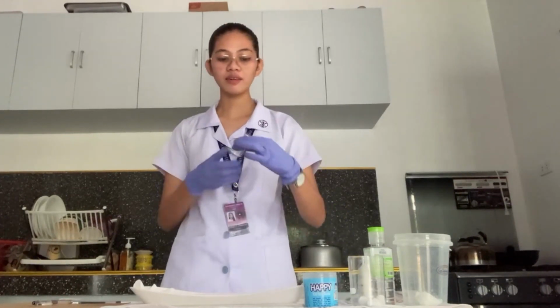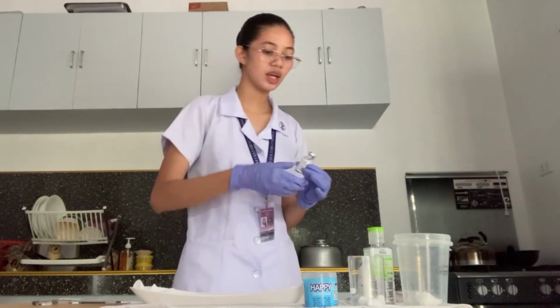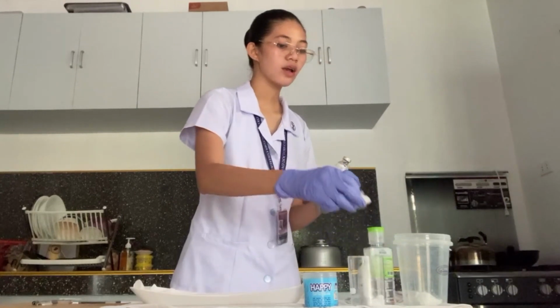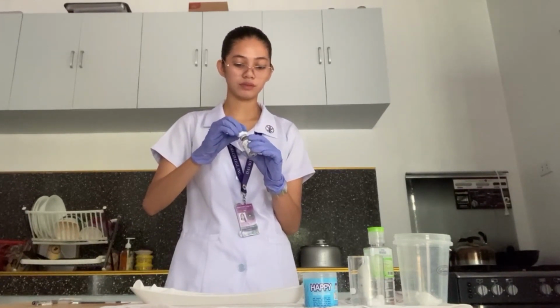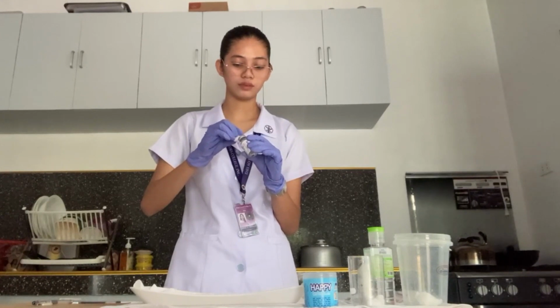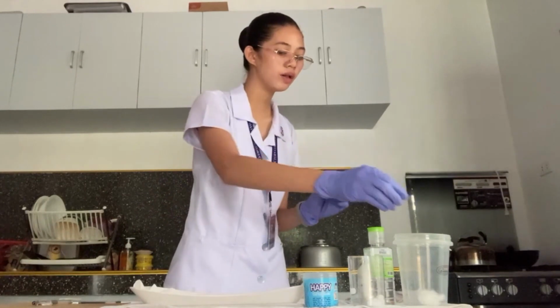After organizing the equipment, we're going to prepare the medication vial for drug withdrawal. Let us first grab our vial, check the label if it's the correct medication, and then we're going to clean the rubber cap by rubbing it in a circular motion for 30 seconds using a cotton ball soaked in 70% alcohol, like so. After that, we're going to dispose our cotton ball, place it on the side, and then we're going to withdraw the actual medication.